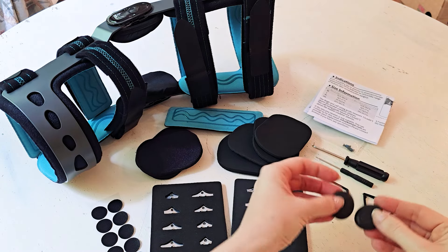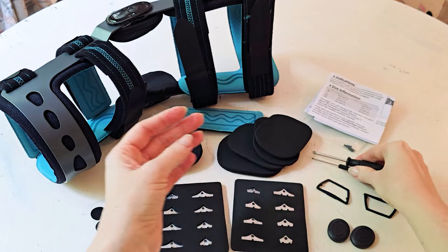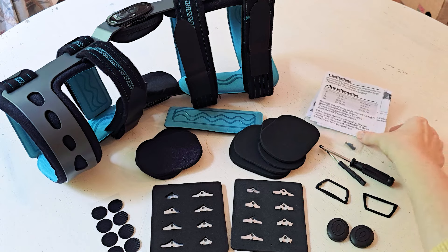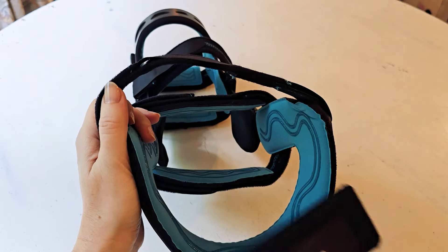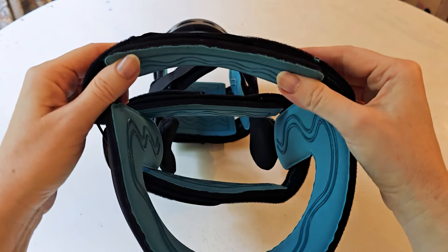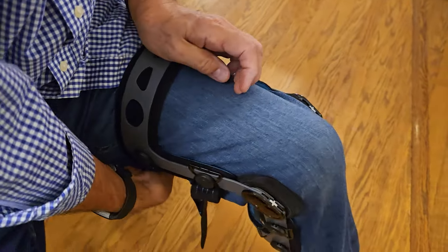You've got extra buckles and added pieces, plus small screwdrivers you need to adjust anything. You get lots of extra padding, so in effect you're getting everything you'll need to use and wear this for a very long period of time. It's really well made — they've thought through everything you're going to need to continue wearing it over time.